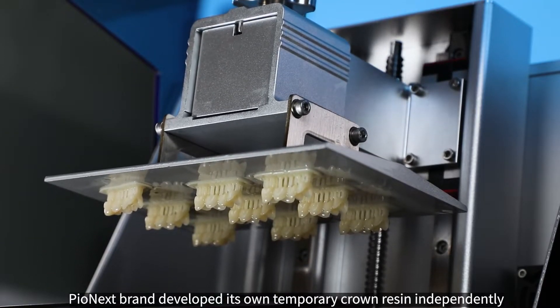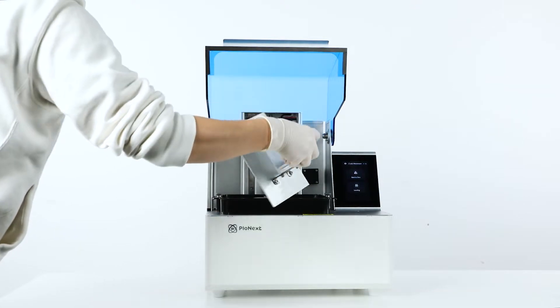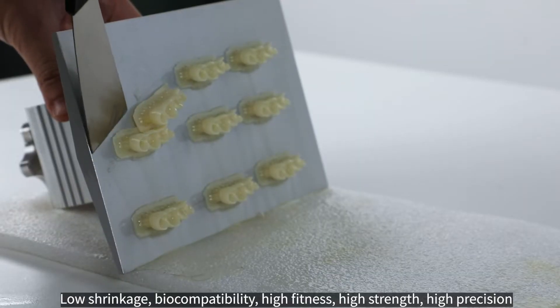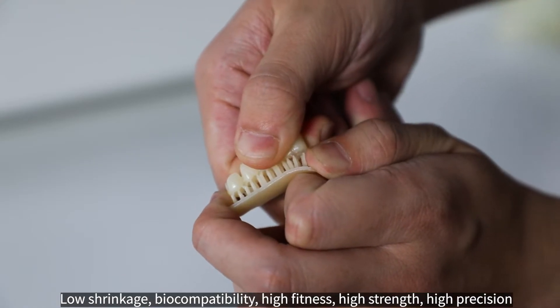Temporary crown resin from Pionext brand is independently developed and performs very well when printing temporary crown models. Using Pionext resin to print temporary crown models has many advantages, such as low shrinkage, biocompatibility, high fitness, high strength, high precision, and smooth surface.